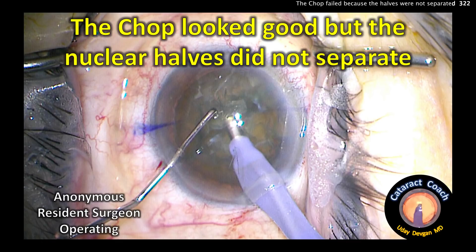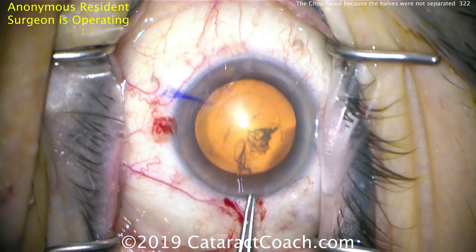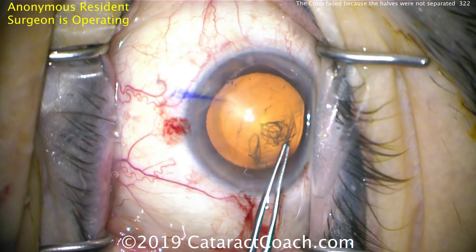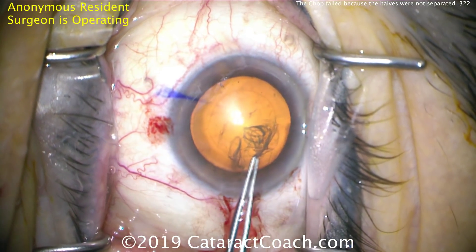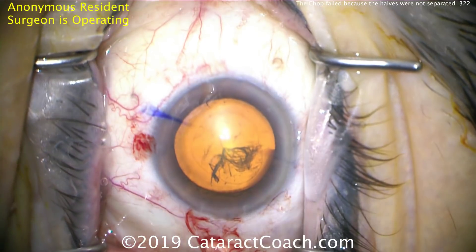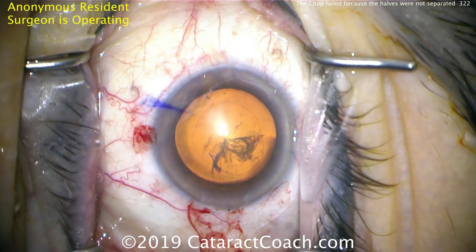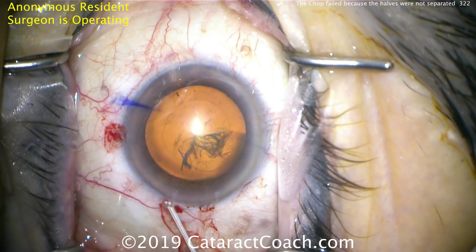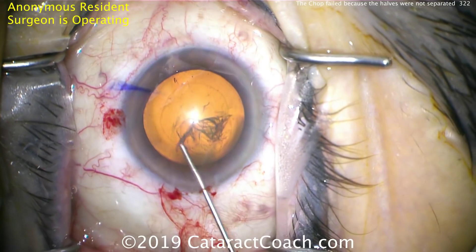CataractCoach.com. This chop looked good, but the nuclear halves did not separate. We have an anonymous resident surgeon operating here, and we're finishing up the capsorhexis — I'll show you just the FACO nucleus removal of this case. It's a nice round capsorhexis, well-centered, appropriate size, about five millimeters in diameter. The cataract is of typical density, maybe two to three plus nuclear sclerosis.